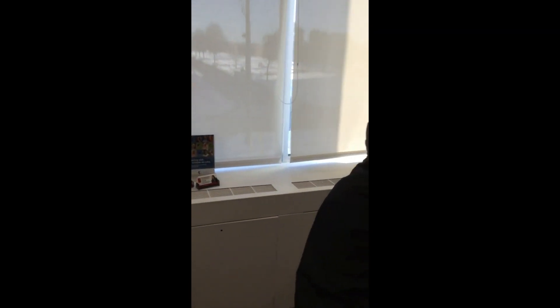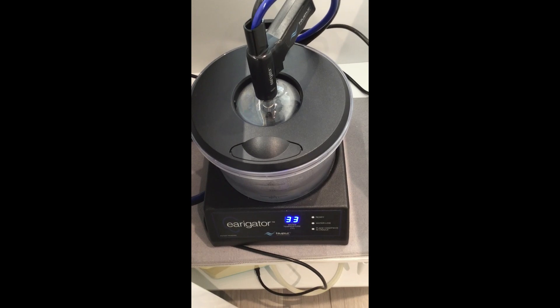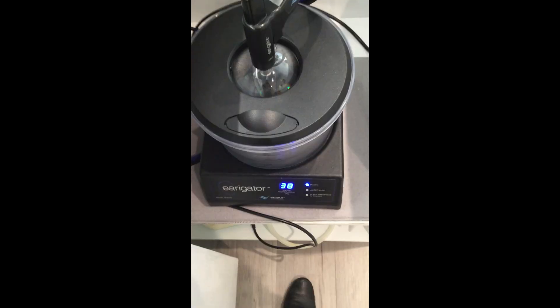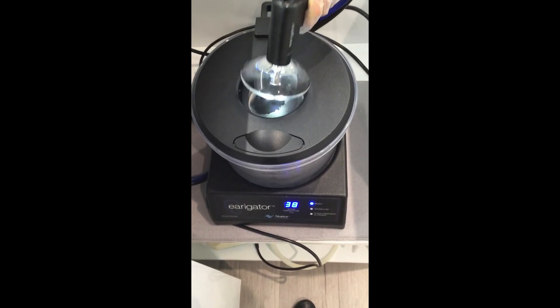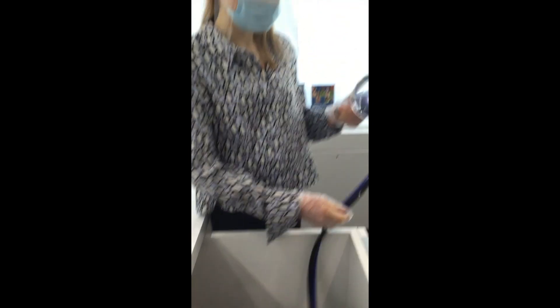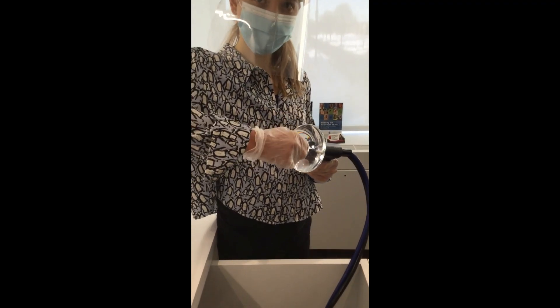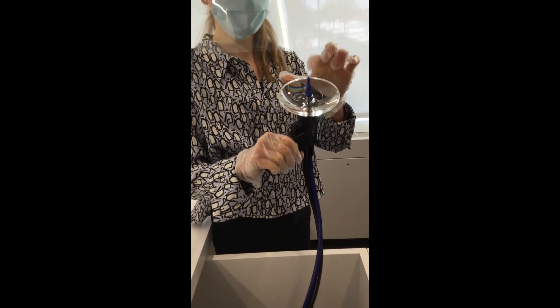Once we're all set, we're going to get our shields on. We're just at 33 degrees — we're almost there. Now we're at 38 degrees, so we're at perfect temperature. Lauren, our audiologist, is going to take the handle out, put the tip on, and apply it to the patient's ear. And we're all set to go.